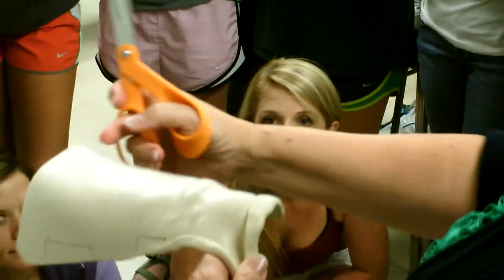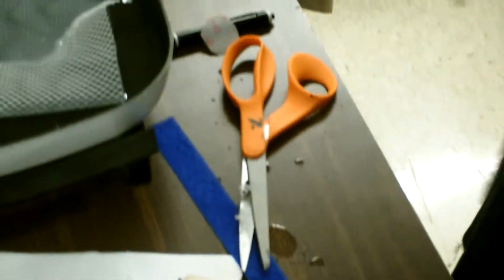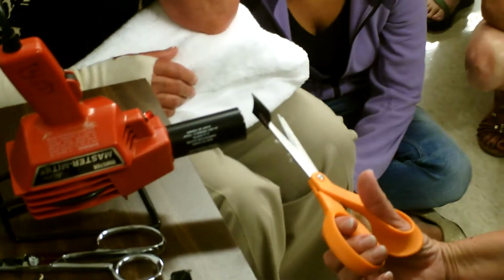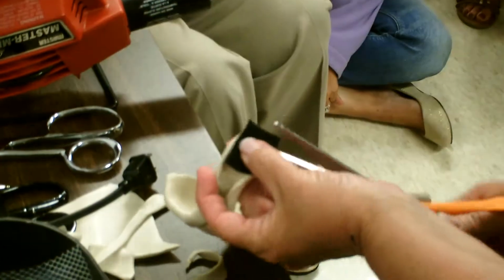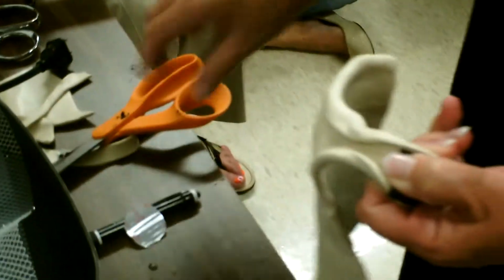So you're going to do all the straps, and then, like the cooking show, how they have a finished one? I don't have one. But there's one over there on the cord, actually. So you heat this. And again, I would do what she did, which is round the edges.